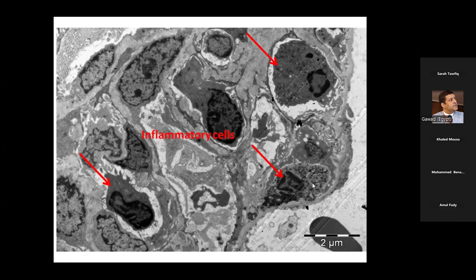We have a question. Kindly explain disease-wise. I cannot get the question. Can you compare between both cells in one slide? Which two cells, Dr. Khalid? Endothelial and inflammatory. In this slide is there any endothelial cells, Sarah? No, these are mainly inflammatory cells.